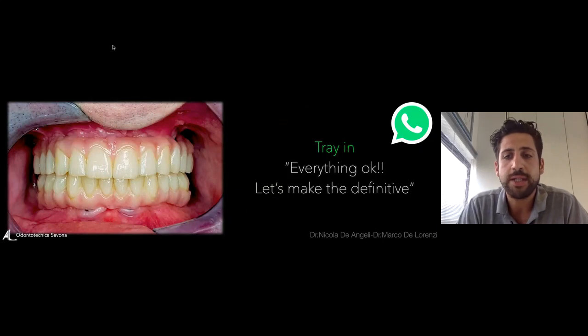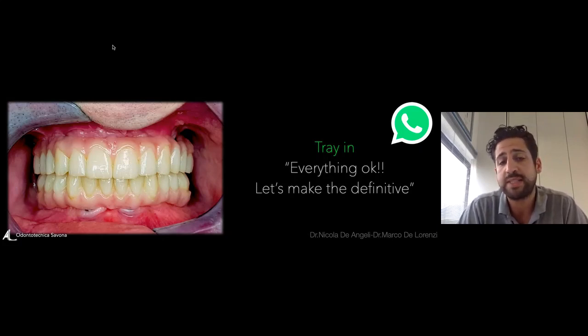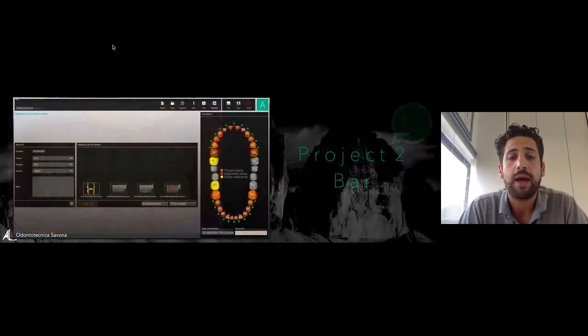After the try-in, the doctor said everything was quite good. Also, the mastication, the patient was happy with that. And so let's make the definitive. Okay, let's see how we can make the definitive.